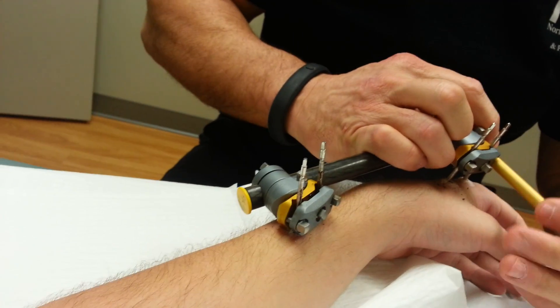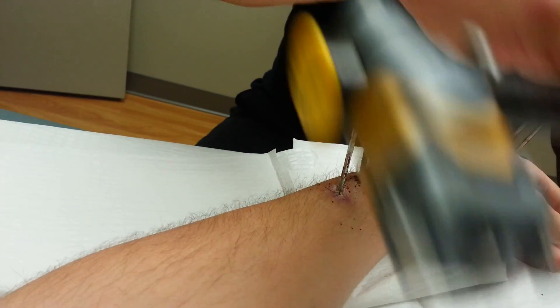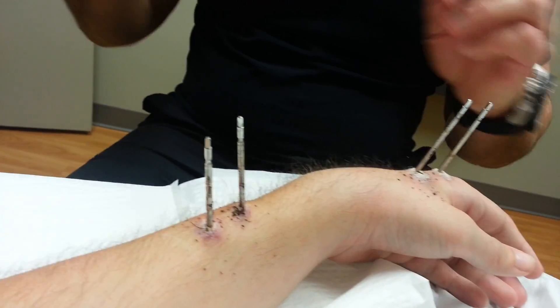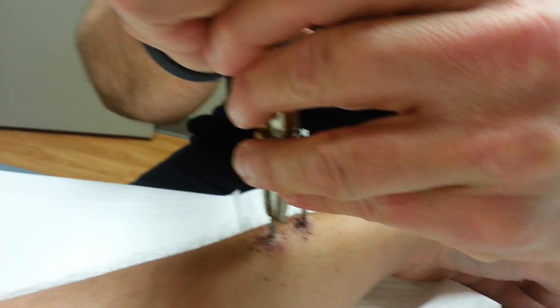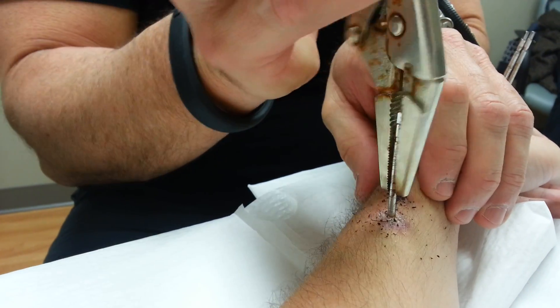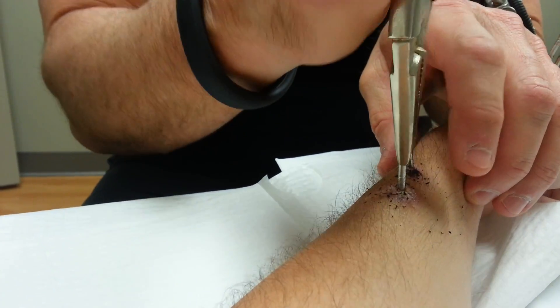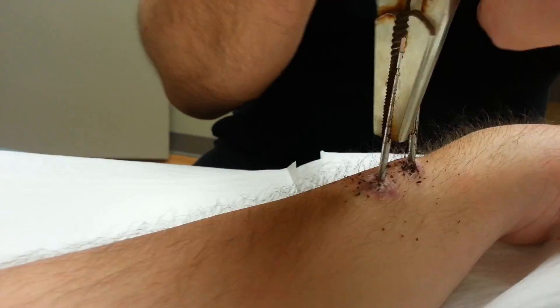That little bit on the outside — we had several people that did that. I was pushing down on this one. It's all crusty. Right as the end of this pin starts to come out of your arm, it'll hit that skin right there and be a little sensitive. Yeah, it's been sensitive for a while.